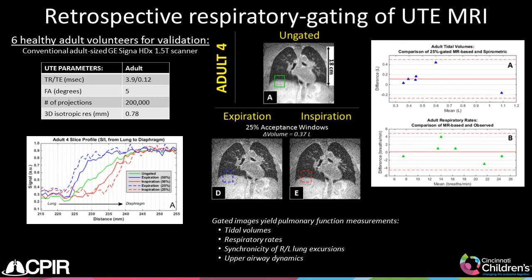In this work, we validated tidal volumes and respiratory rates from UTE MR-based measurements against measurements from a standard adult pulmonary function test, with good agreement across the cohort.